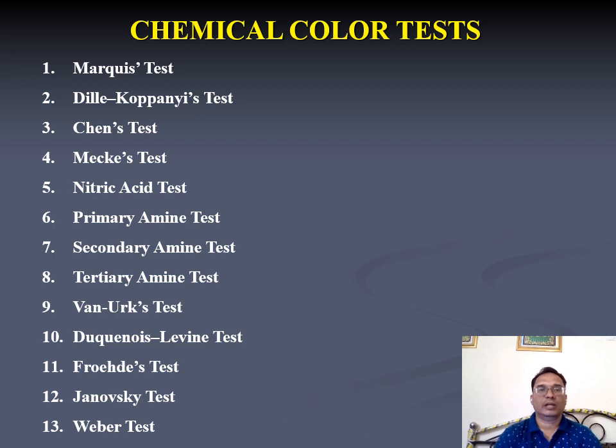These are the few chemical tests which are routinely used in the forensic laboratories, and these are very important, and these are specific to the particular type of control substances. Like this Marquis test is specific for amphetamines and other alkyl aminoketones. The Dille-Koppanyi test is specific for barbiturates.